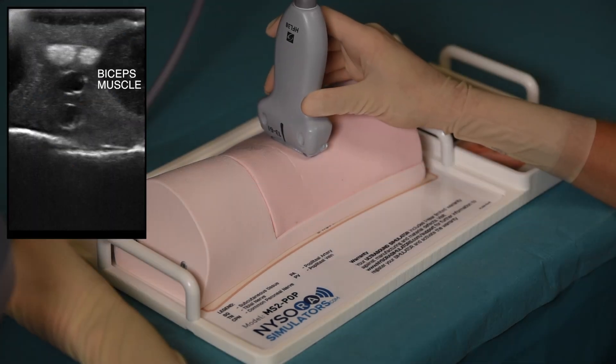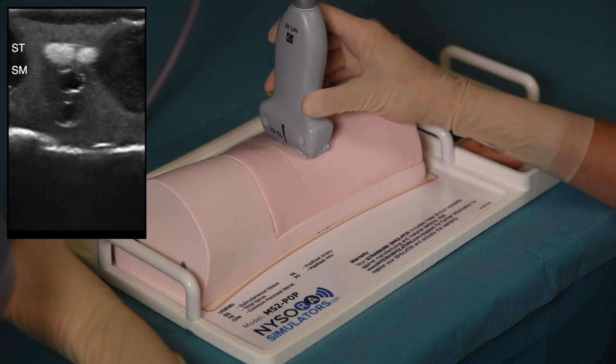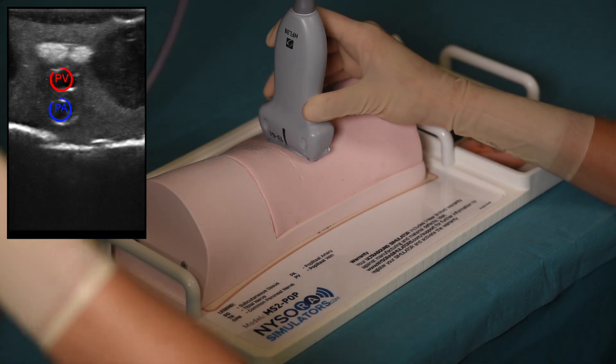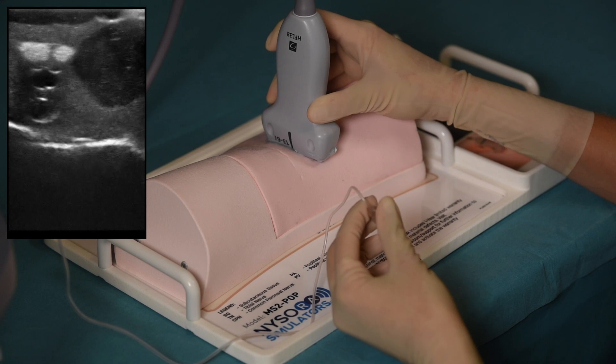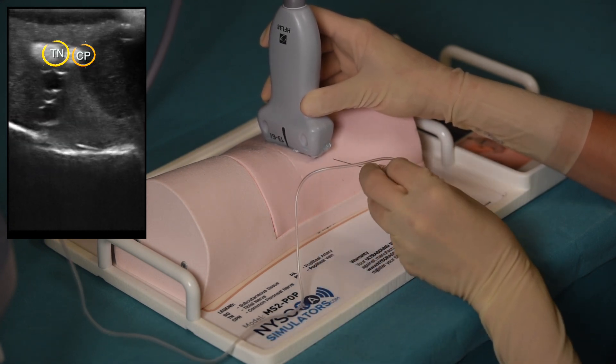On the ultrasound image, we can see the biceps muscle laterally, semitendinosus and semimembranosus muscles medially, the popliteal vein and the artery, and the sciatic nerve in the popliteal fossa. The scanning is performed until the tibial and common peroneal nerves separate to allow for needle insertion between them.